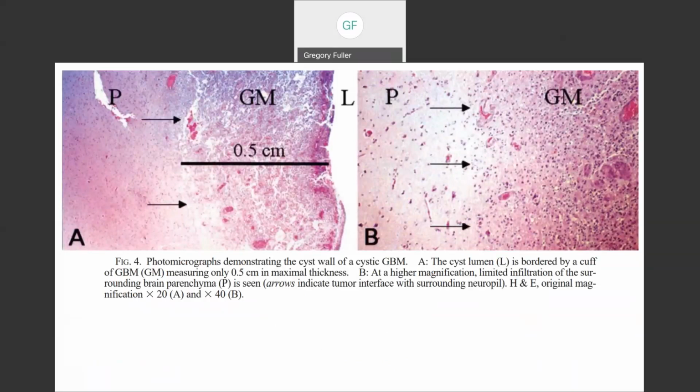There are no tumor cells here. If this had been an IDH mutant, you would have found virtually no cells out here labeling. Look how narrow it is. That is cystic glioblastoma. And hang on a second, that is why the first stereotactic biopsy missed the lesion, because you're either in the cyst and you get fluid, or you're in the brain around it and you get essentially normal brain, mildly hypercellular, non-diagnostic. You have to hit that 0.5 centimeter rim. It could be a difficult hit for a stereotactic biopsy. And this is, again, a current case.